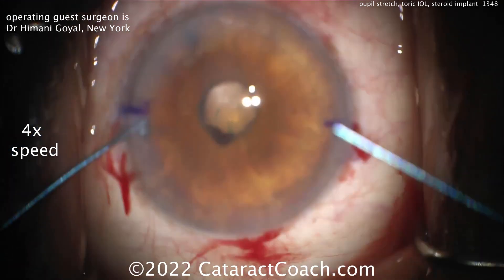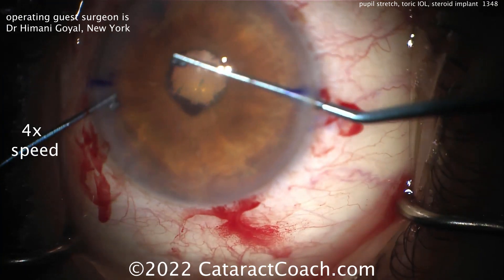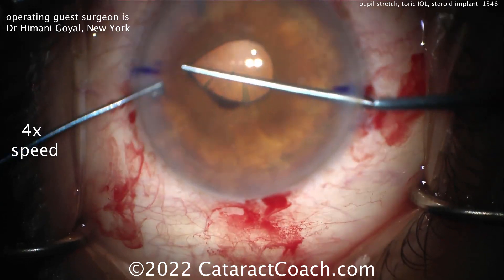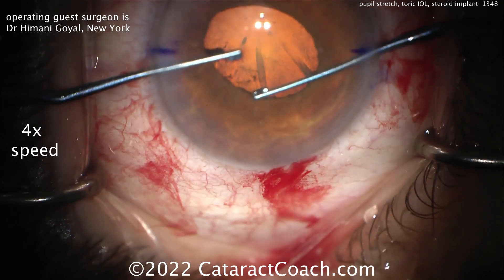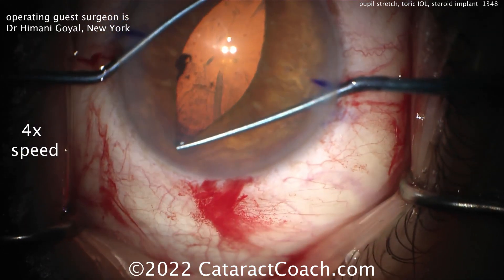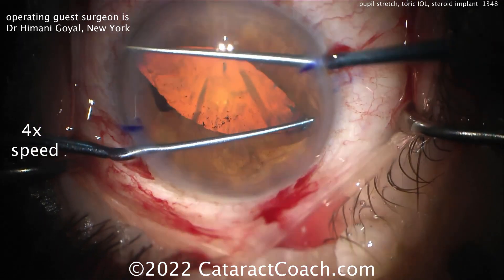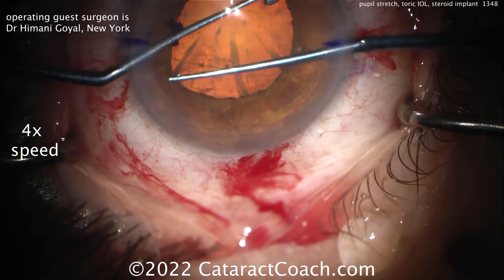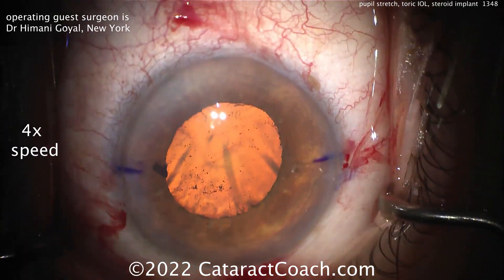Let's see the pupil stretching and breaking of the synechiae using two Kuglen hooks. Going under the iris and gently going around — that's a very slick maneuver. I like that 360. And now dilating the pupil by stretching it in two different directions. That looks great — that's probably going to be a sufficiently large pupil to complete this case. Remember, the patient's also getting a toric lens, so you definitely need the pupil sufficiently large to see where the toric lens marks are so you can get it lined up appropriately.